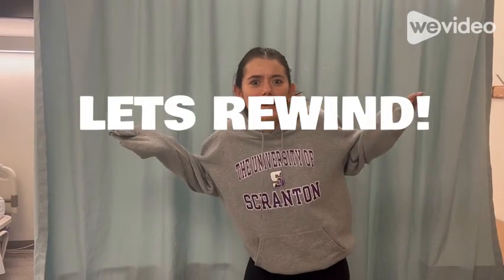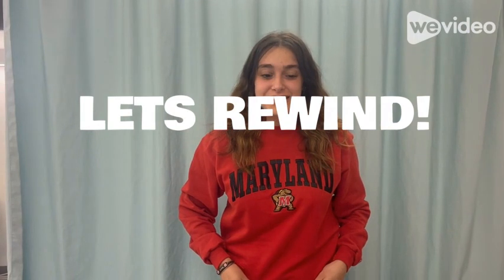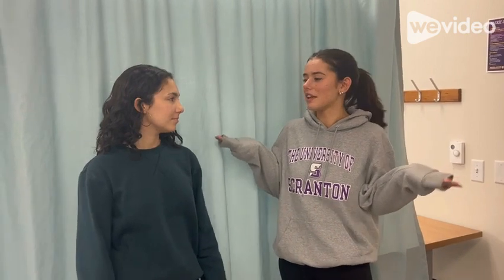So what is an EKG? An EKG stands for electrocardiogram, that is used to record the heart's electrical activity and rhythm, so it involves putting electrodes on different parts of your chest and abdomen. So how exactly does an EKG work?